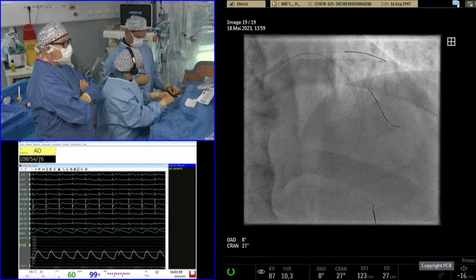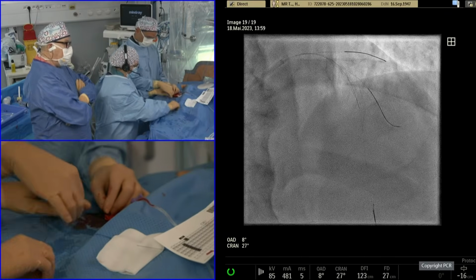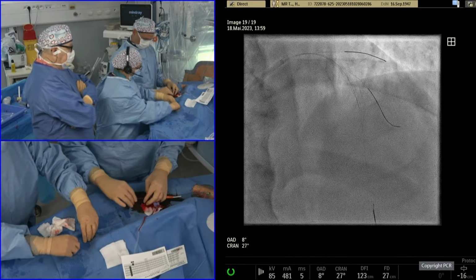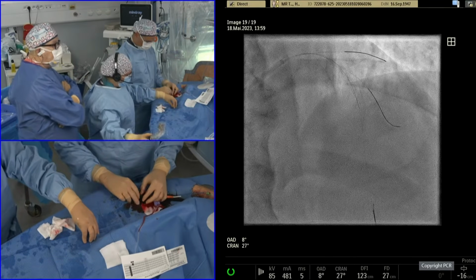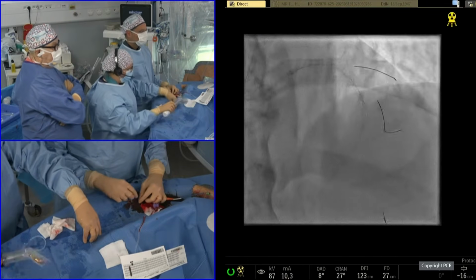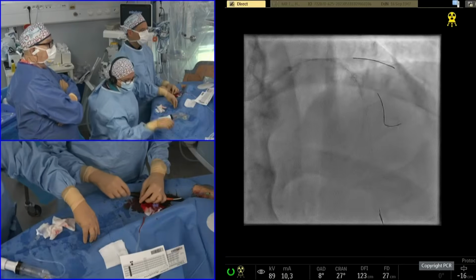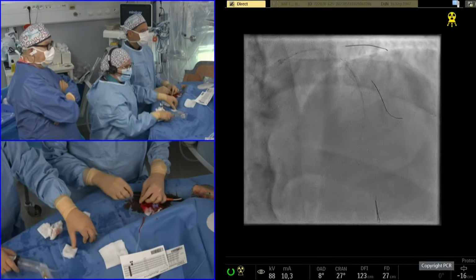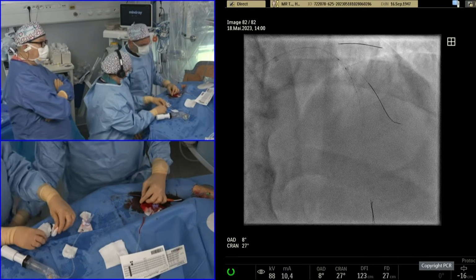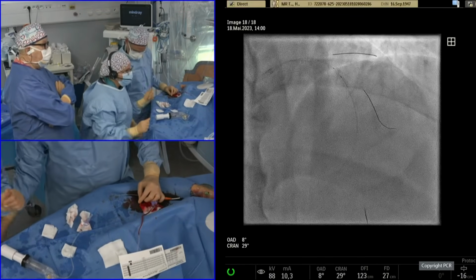And I think it's the first time we show clinical benefit. We reduce from 6 to 4% the rate of TLF at 1 year just by doing a POT. And I think it's very convincing data to generalize this approach. The POT is very important because you select a stent according to the distal reference, and you need to correct this undersizing of the proximal part. The POT is a key element in the approach to bifurcation lesions.